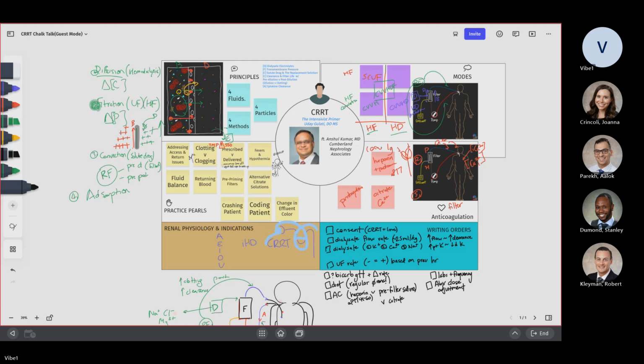I'll look into what blood and fluids can be given in the post-CRRT line. A lot of what we do, like CVVHDF and everything, is more done with the Gambro and Braun machines, which are very complicated. The Fresenius one is a very simple and easy machine, and that's why a lot of institutions have it, because of the ease of use.